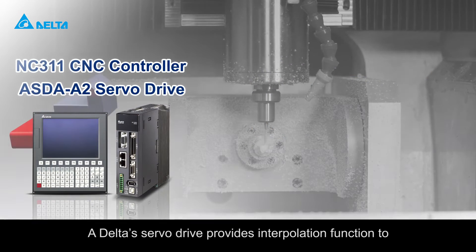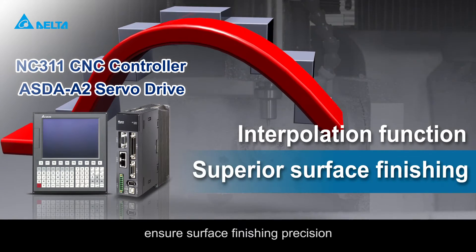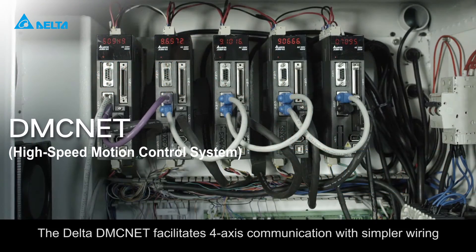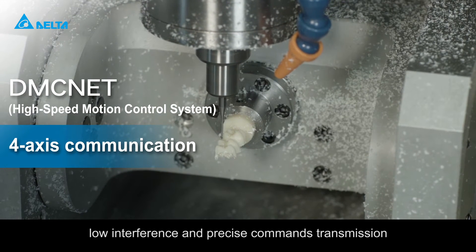A Delta servo drive provides interpolation function to ensure surface finishing precision with a stable and smooth operation speed. The Delta DMC net facilitates four-axis communication with simpler wiring, low interference, and precise commands transmission.